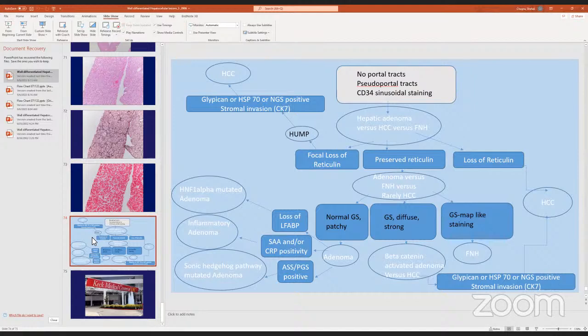So did they try to subclassify that adenoma at that point? Yes, they saw that it was likely inflammatory, and beta catenin was focally nuclear, but it was very, very focal. I reviewed the slides; it was very focal. Those can get very tricky. With the focal beta catenin, maybe they should go for molecular profiling.